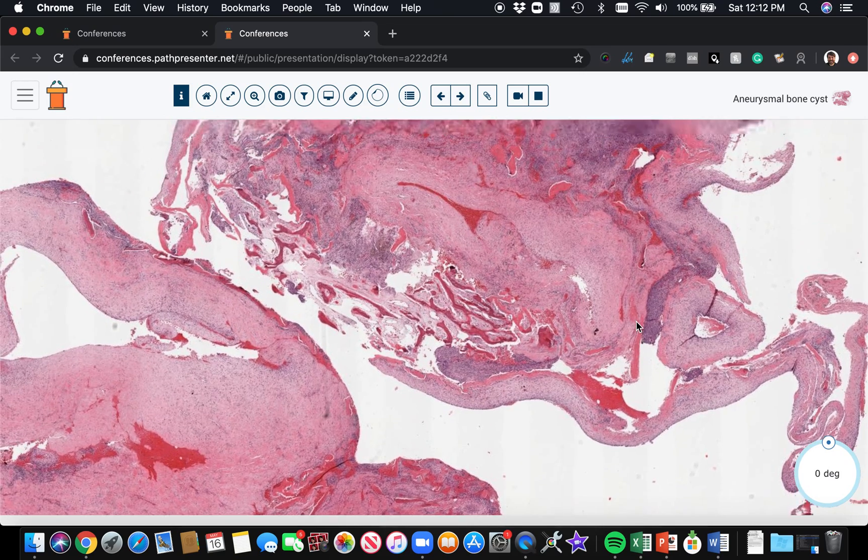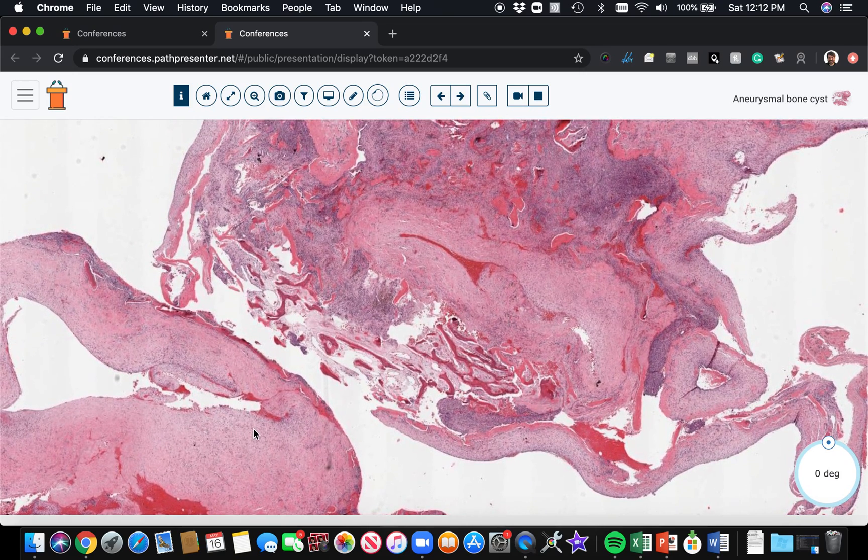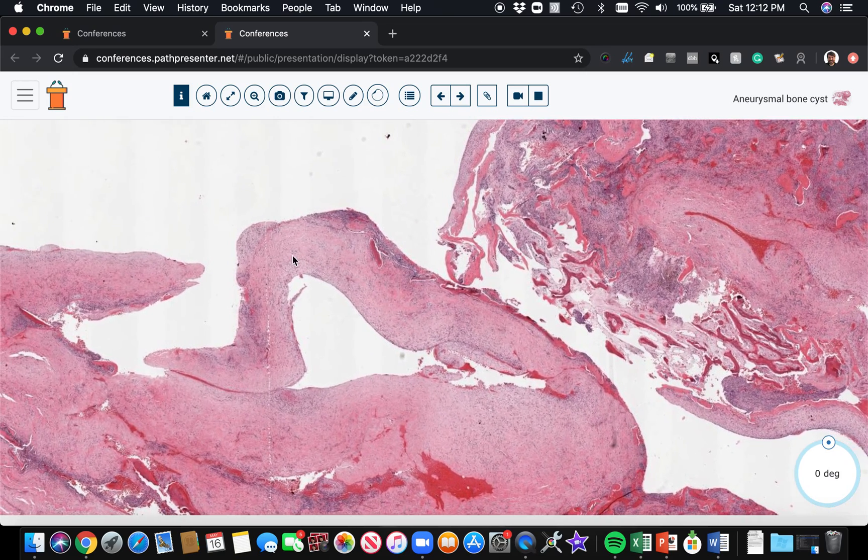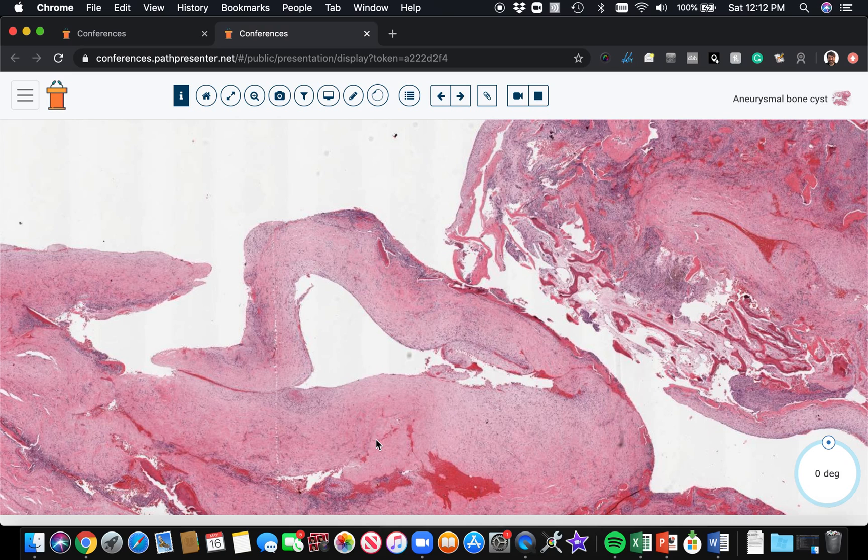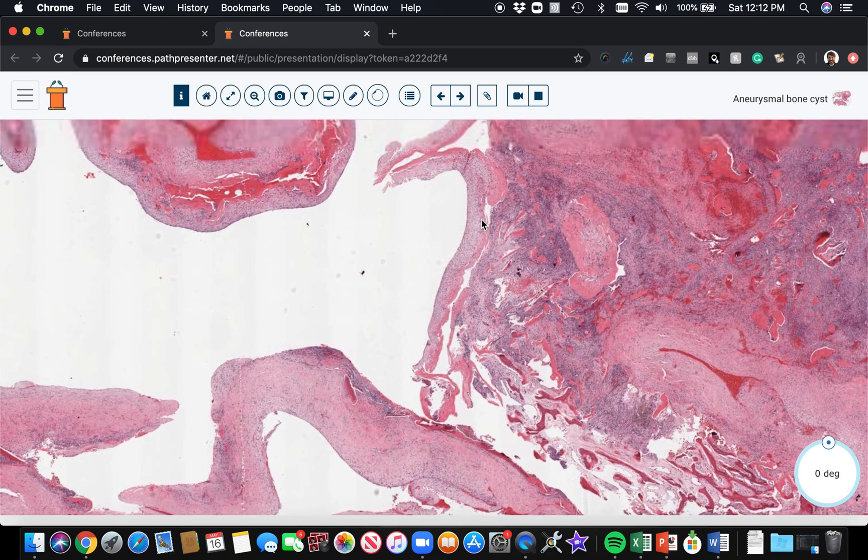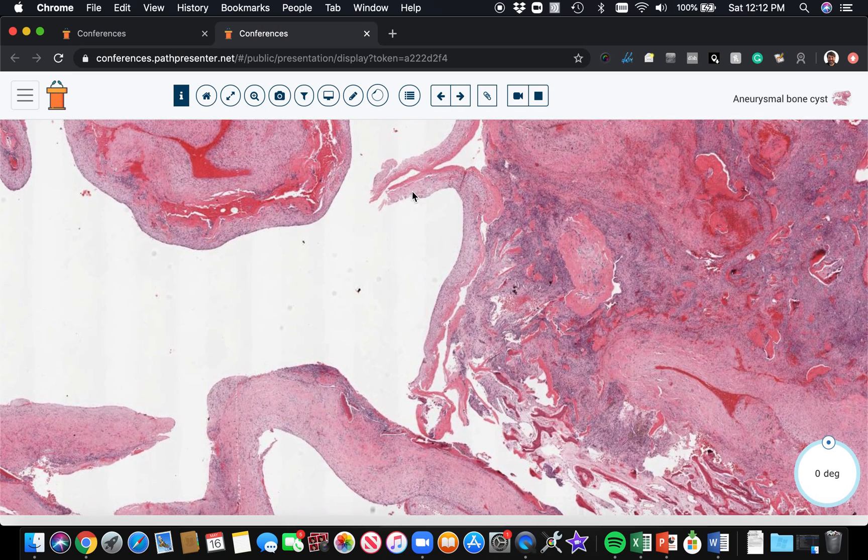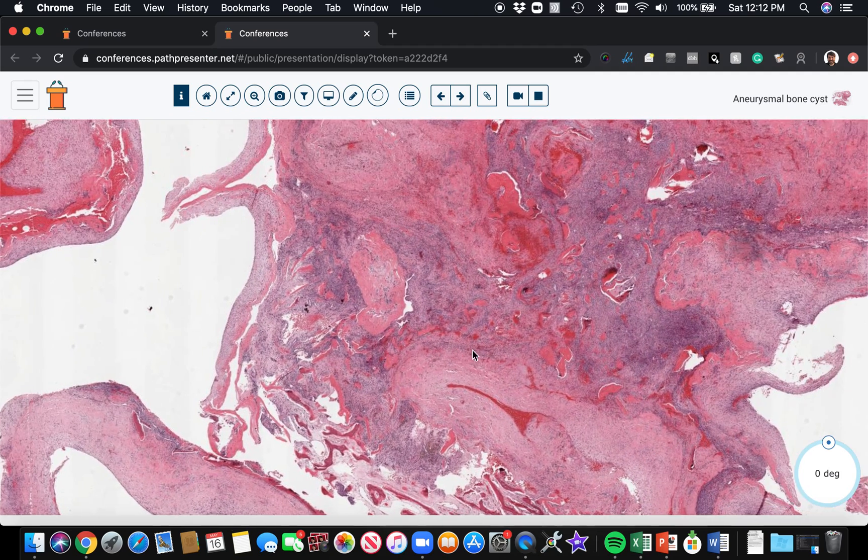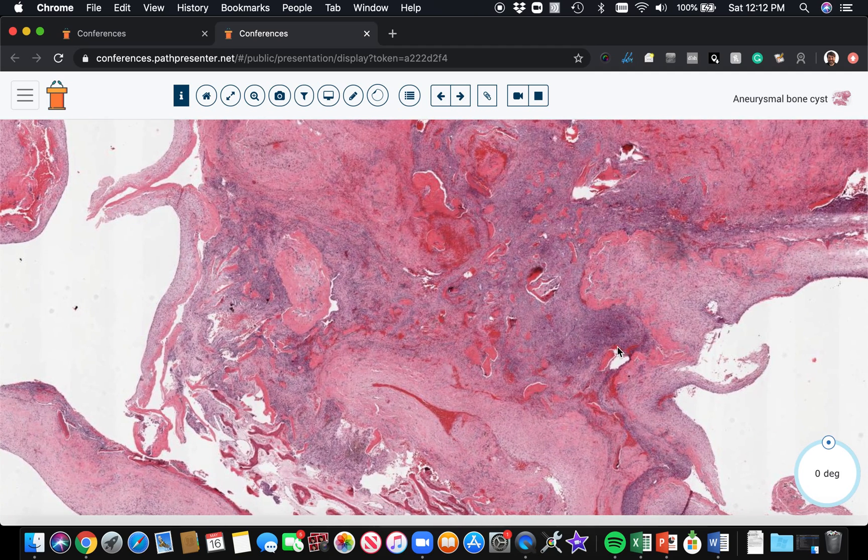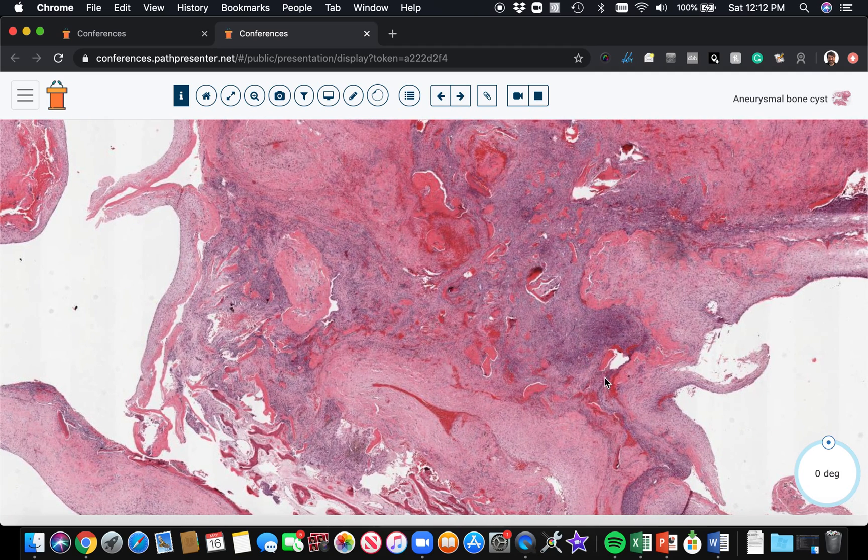And remember, giant cell tumor bone can have aneurysmal bone cyst formation - secondary aneurysmal change. Okay, so the way to tell them apart - there are cases in real life that can be really challenging to tell apart and sort out for certainty, but here the vast majority of the lesion is this kind of fibrous and fasciitis-like loose tissue and bone.